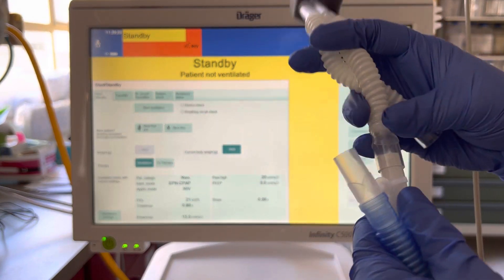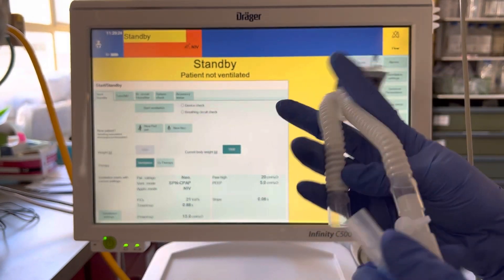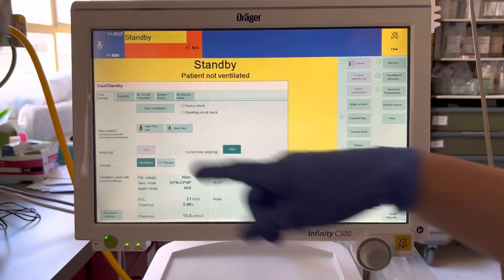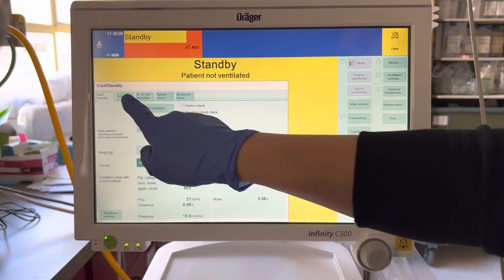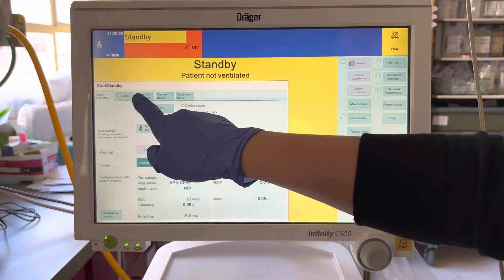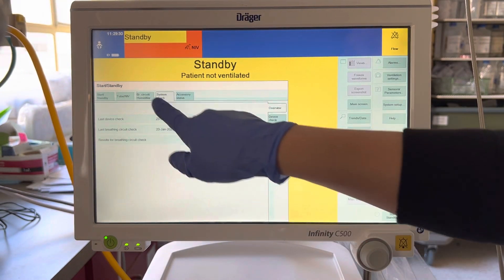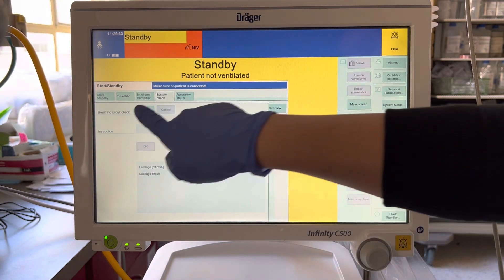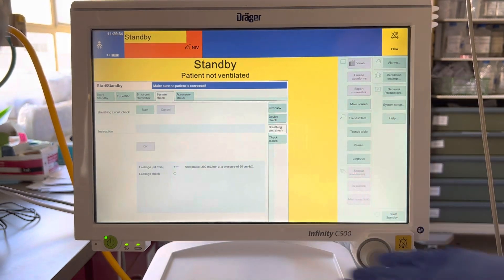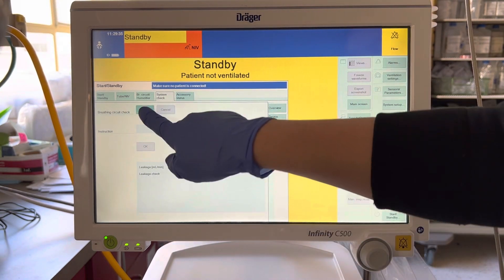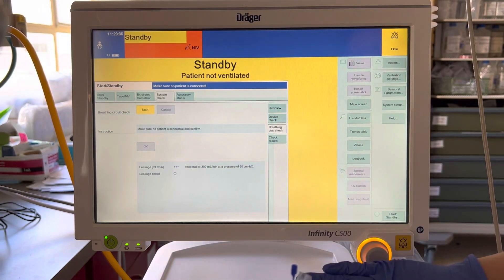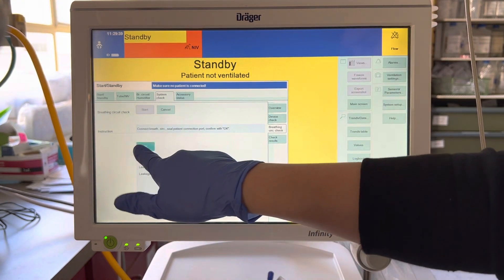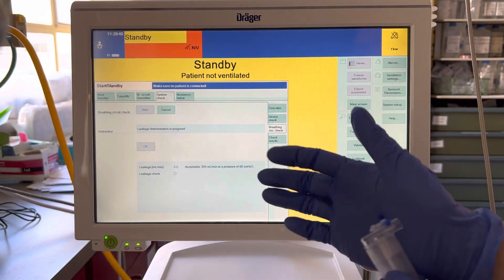Go ahead and go to breathing circuit system check, then breathing circuit check, press start, confirm, follow the prompts, press okay.